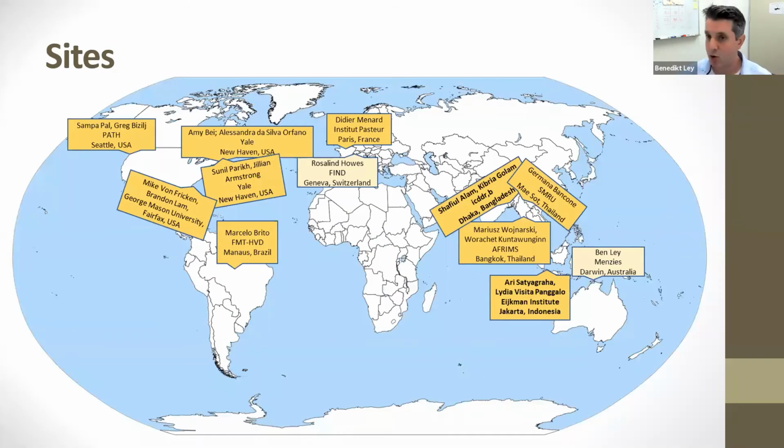So given that our coefficient of variation by biosensor for the high controls was below 15%, we proceeded to phase B. Each machine, together with a set of standardized controls, was sent out to a separate laboratory. Four of these laboratories were in the US, one was in Brazil, one in France, and four were in Asia.